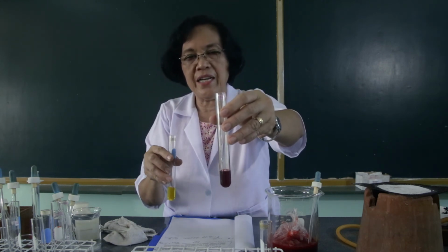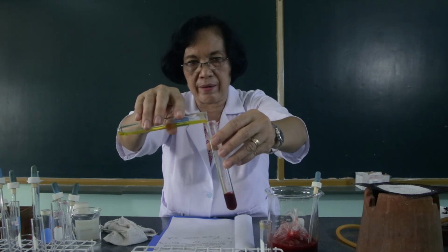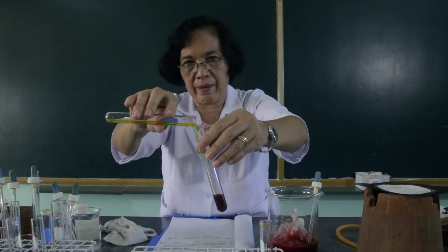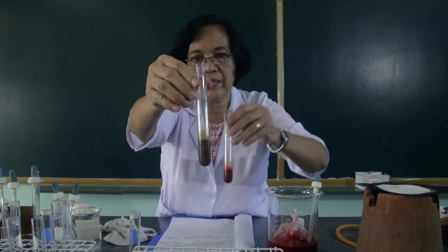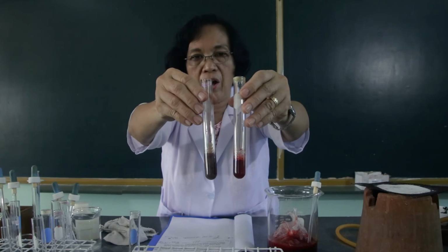Then, with this mixture of the Stokes reagent and the ammonium hydroxide, I'm going to add this reagent to the second half of the oxygenated hemoglobin. And I want you to compare the two. This is now the reduced hemoglobin, while this was the oxyhemoglobin. Observe.